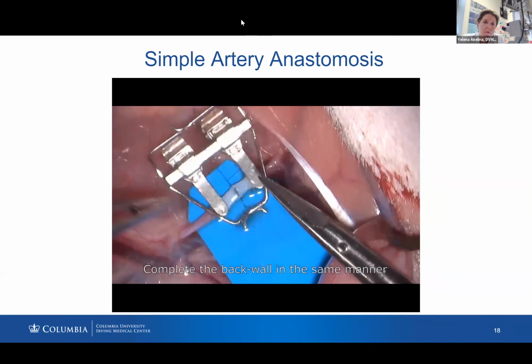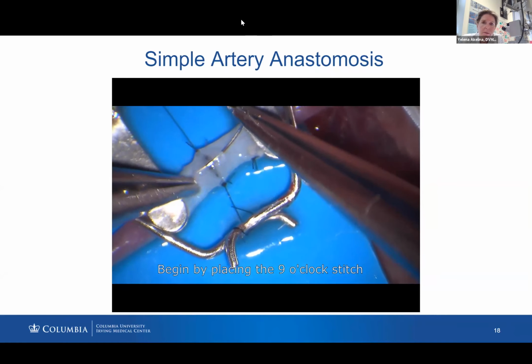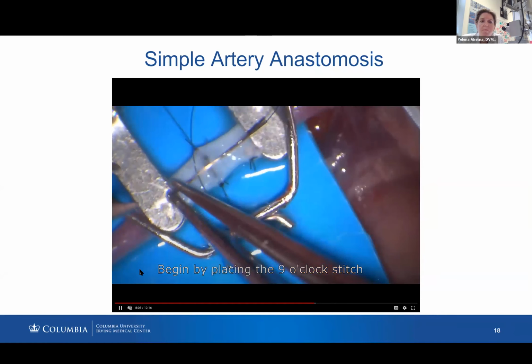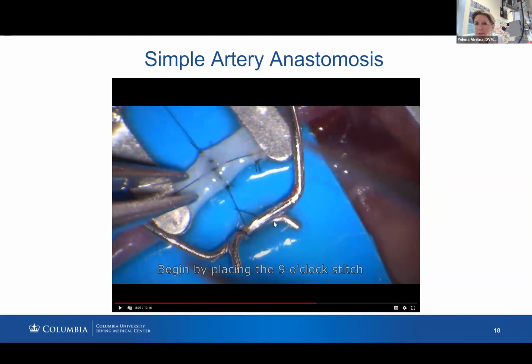The distance, well, it depends on the size of the vessel. So here probably maybe I'll say 0.5 millimeter. I never really measure it, honestly. But if you put even stitches evenly, then you can see the distance.